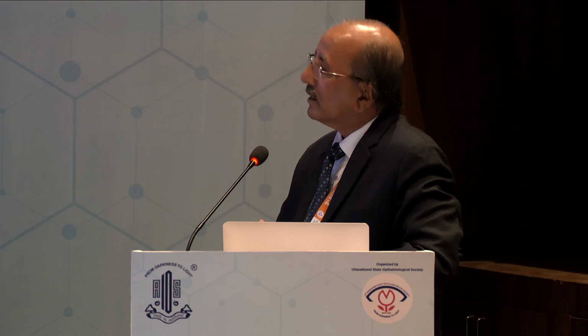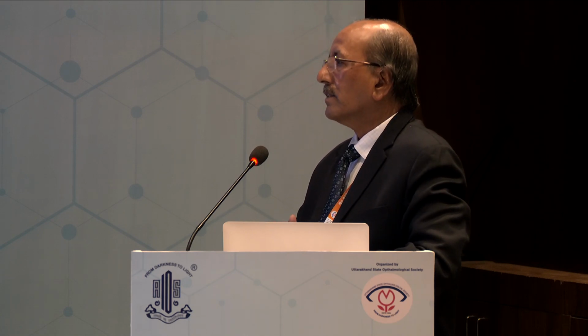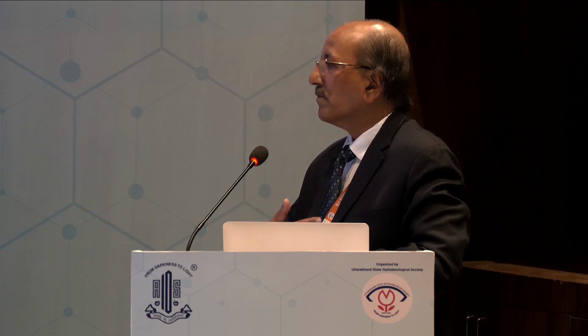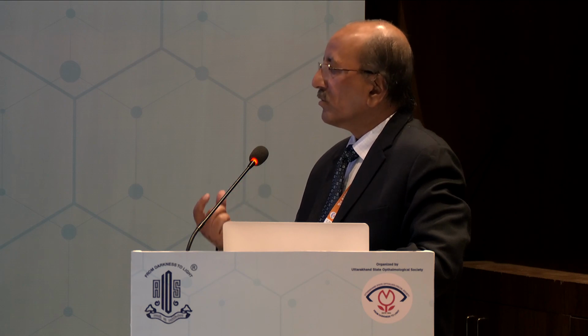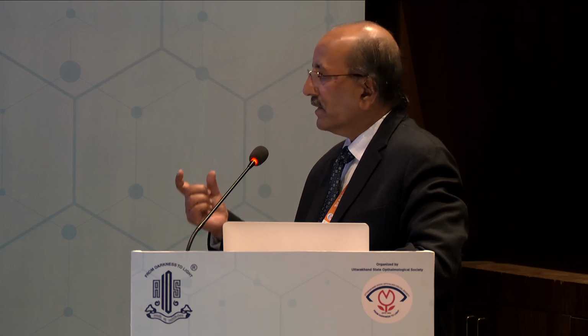Although I have operated even a 1-month-old child, and I have followed that child for a long time, more than 15 years, because there is no microphthalmos, axial length is more than 16.5 or 17 millimeter. If it is a unilateral cataract, even less than 6 months we implant an IOL. But where there is a contraindication, I think you should not implant.